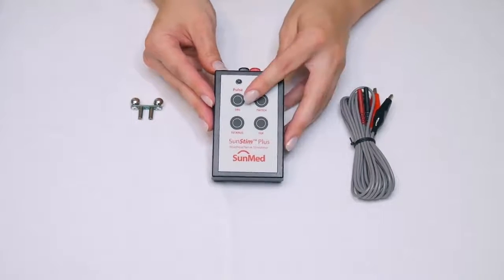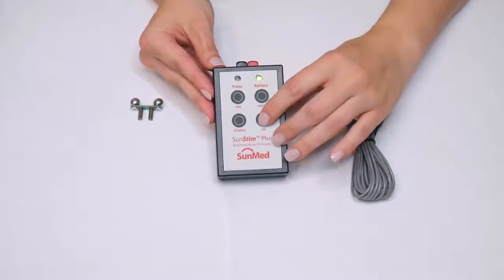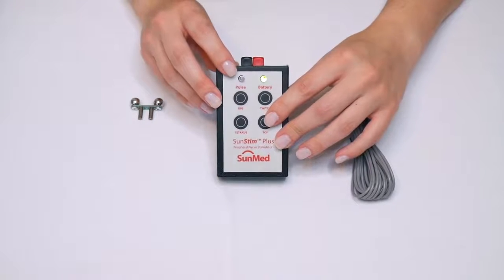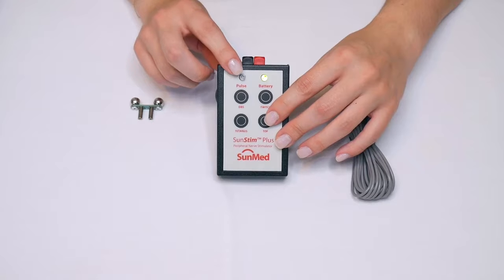With the SunStim Plus, you have four modes of stimuli. When you click on any of them — in this case, train of four — you will see the pulse setting flash yellow and hear an audible click with each output current.